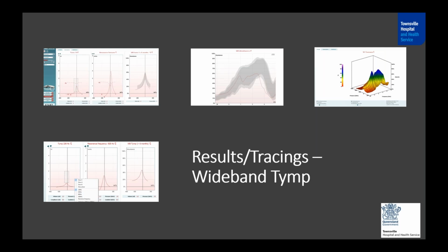So probably you will get reduced absorbance up to around 1.25 kilohertz, but with one sharp peak around 1 kilohertz. That's the pattern you would expect if there's a combination of otosclerosis and a flaccid tympanic membrane. And again, the resonant frequency will be higher, because your flaccid tympanic membrane could be because of a healed tympanic membrane perforation.